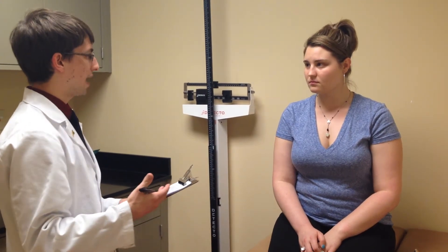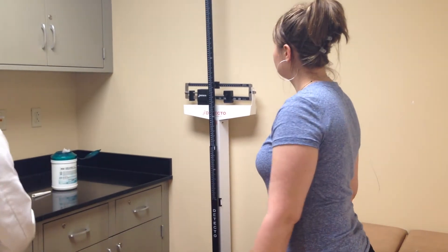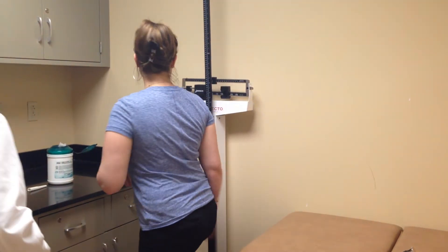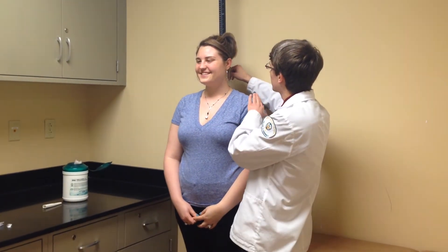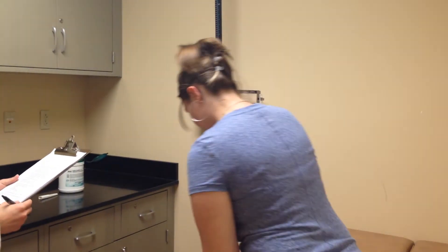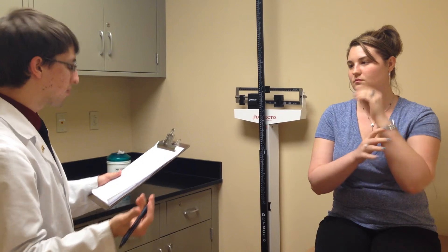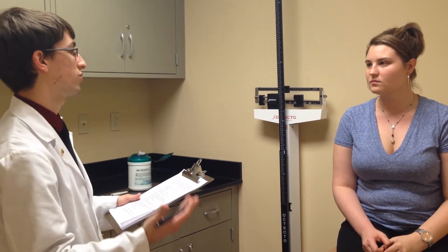So we're going to go ahead and calculate your BMI. Do you know your last recorded weight? 170 pounds. Can you step over to the measurement scale so we can take your height? Please take your shoes off — and your hair does not count. You have a height of 5 feet 6 inches, which is 66 inches, or about 167 centimeters. That brings your BMI to about 27 to 28, which means you're slightly overweight. Tell me something about your diet. I'm a student, so I can't really watch what I eat — I'm always on the go. Are you getting enough exercise? No. You're still doing pretty well with your BMI. I know it's kind of hard as a student to keep your weight down.